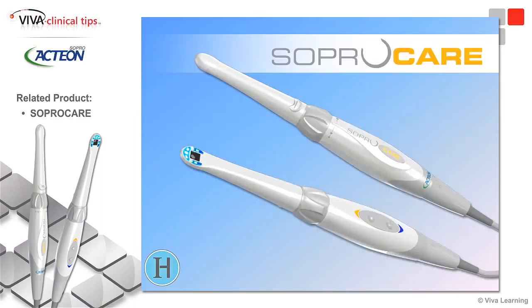Now, the other great thing about this camera is that there's no buttons to switch and push and to fumble with. There is a toggle. It's just a simple toggle that switches between this. The other thing about this camera that I love is that you can do a full face view, so no more external cameras with all of the lenses and all the cheek. You still use the cheek retractors and things, but you don't have this big camera with all these settings on it. You take this camera at one level and take a full face.